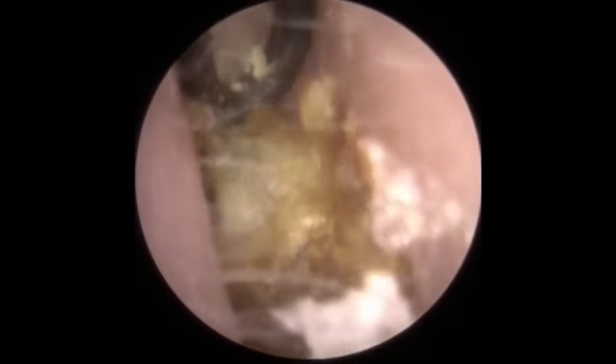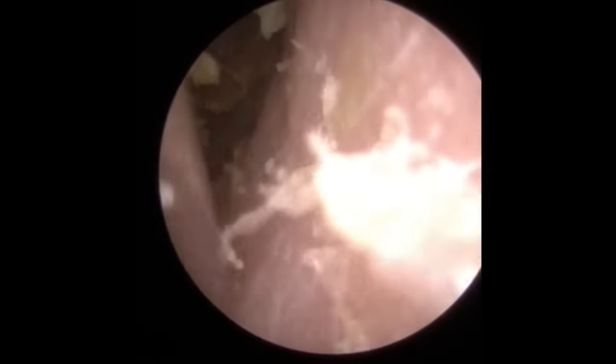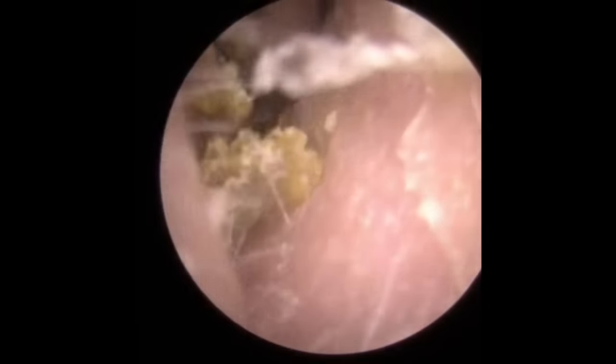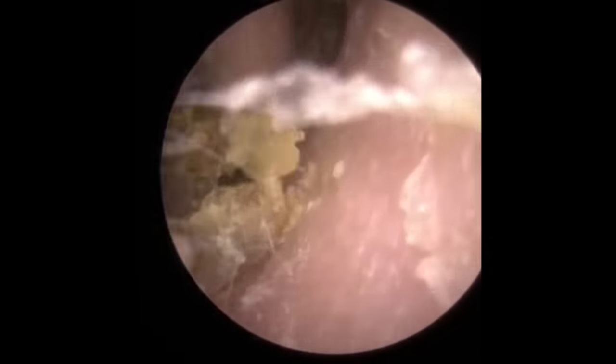You can see where the Jobson horn is pulling the central sections of wax out, but obviously it's leaving the sections stuck to the canal walls on the left and right. It's just flicking against the side — it's not actually bringing this forward. You've got to push against the side of the wax to bring it out, so it's just taking central pieces away and leaving the outside edge sections. Which is why we change tools quite often. So this is the crocodile forceps going in now. We're trying to see if we can get a grip on some of this wax because it is quite dry — sometimes if you get a nice piece you can get a good grip on, it'll bring a big chunk out with it.